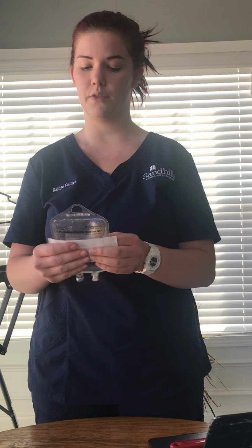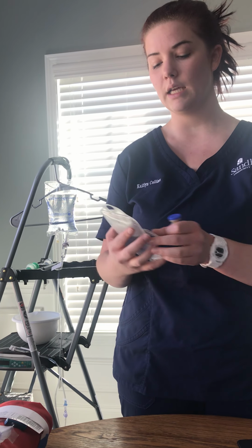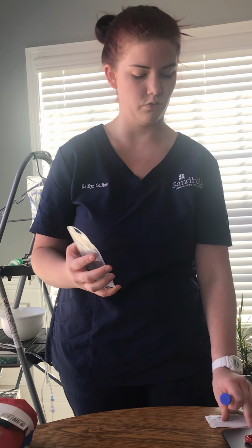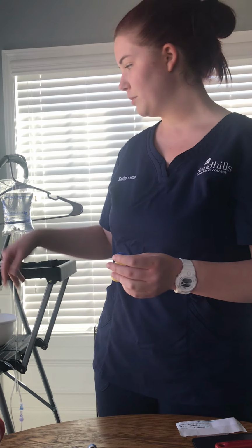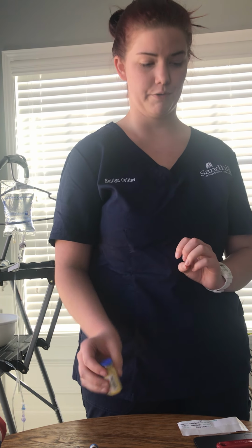It's compatible with the 0.9% sodium chloride, and the order wants us to dilute and reconstitute it with this 50 milliliter bag. So that's what we're going to be doing. The fluids that are already set up are also 0.9% sodium chloride, so that is compatible as well.